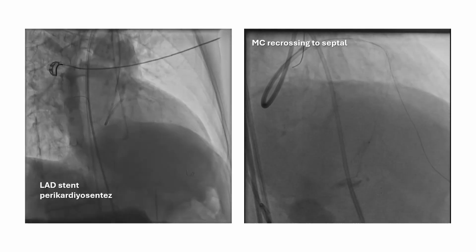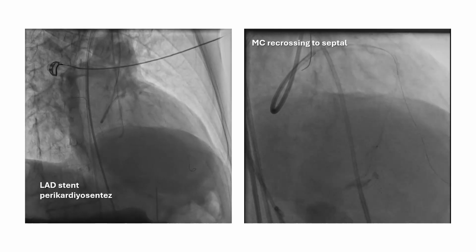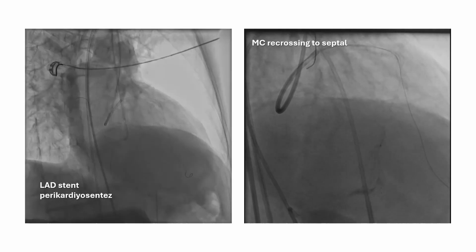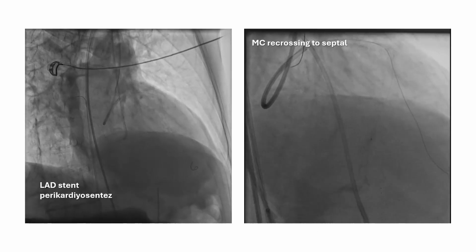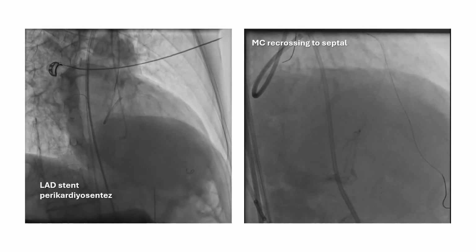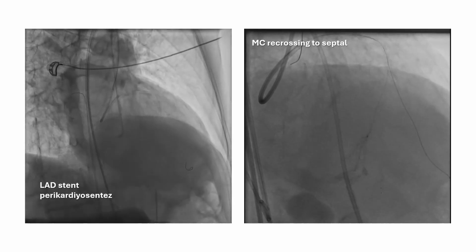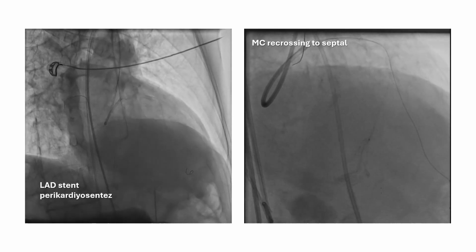The patient also experienced hypotension. Pericardiocentesis was performed because tamponade was beginning to develop. The patient stabilized after pericardiocentesis. We decided to occlude the septal branch with subcutaneous fat to stop the perforation. You can see the pericardiocentesis needle.